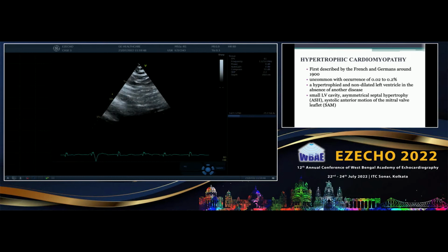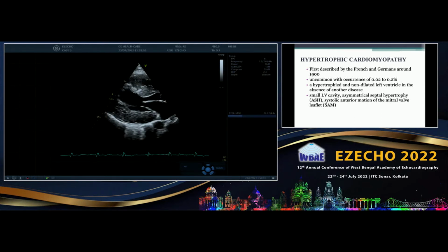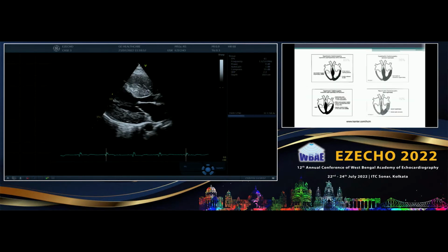I think probably in a cardiac CT it is much better. Cardiac CT is the perfect way to get the tricuspid annulus. Not on the MRI. You don't get that three-dimensional data in MRI.